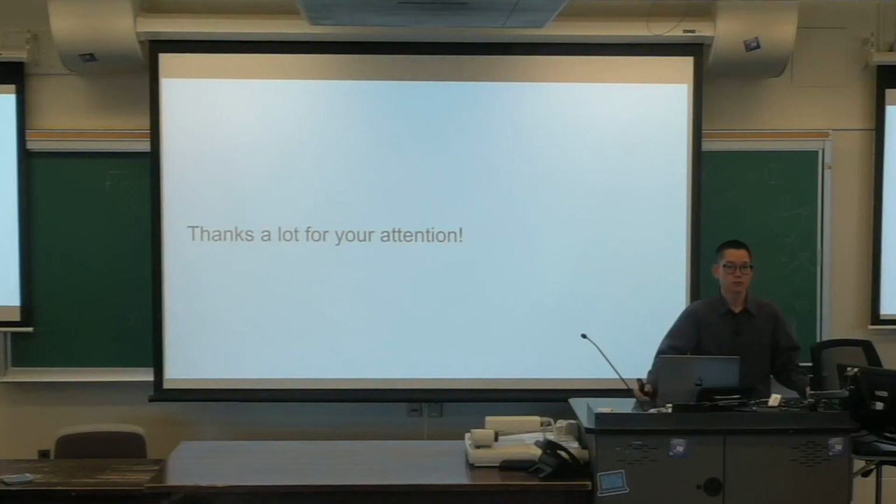And did you try the semi-supervised approach with only the EMG reading? Try the semi-supervised algorithm with only the EMG? Yeah. We didn't, because the intuition is the semi-supervised learning algorithm goes really well with multimodality data. If you have a single modality, then when concept drift happens, there's no room for you to play with. But when you have multimodality, when concept drift happens, if EMG is subject to this concept drift, then you can rely on other modalities, right? That's the idea behind the semi-supervision. So yeah.